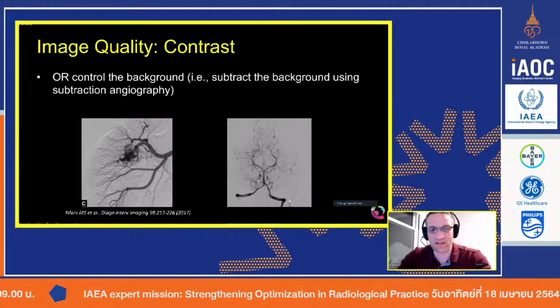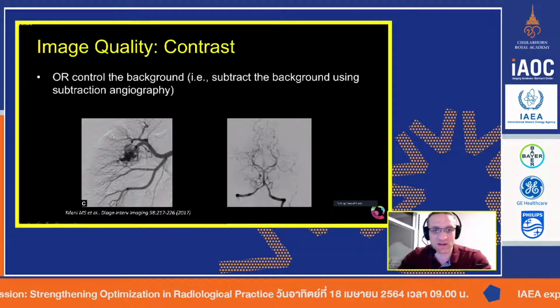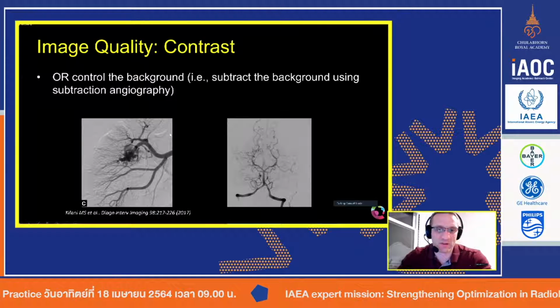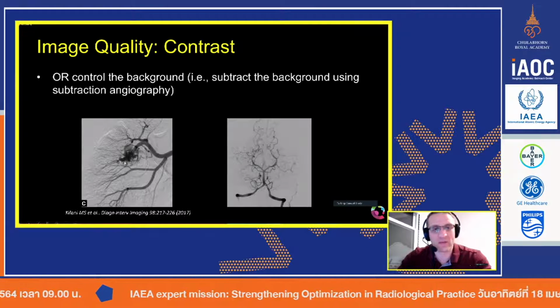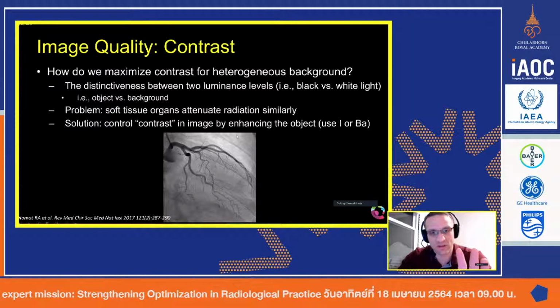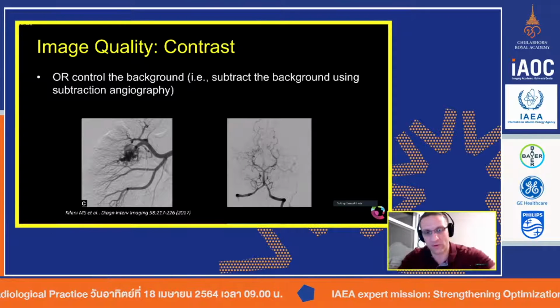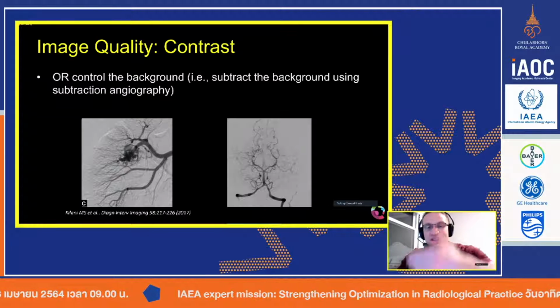And so nice here, it's nice and rigid in the head. And so we don't have to worry as much as down in the body. If we're doing, say, anywhere in the kidneys or something, you're going to get some kind of movement. And so therefore you're always going to have a little bit of motion artifacting. That can occur, of course, in the head. But for the most part, what we're dealing with here is we're reducing the background. So we either one, inject and make the foreground stick out, or two, we get rid of the background, make it uniform so that the object itself has the same contrast throughout.